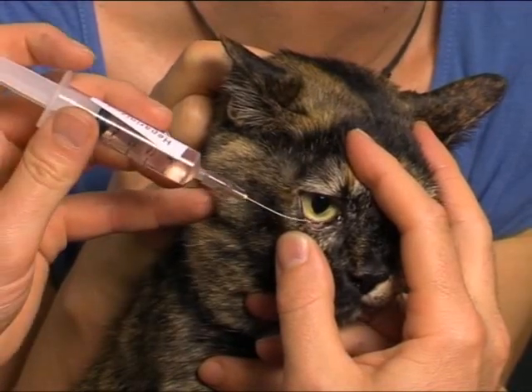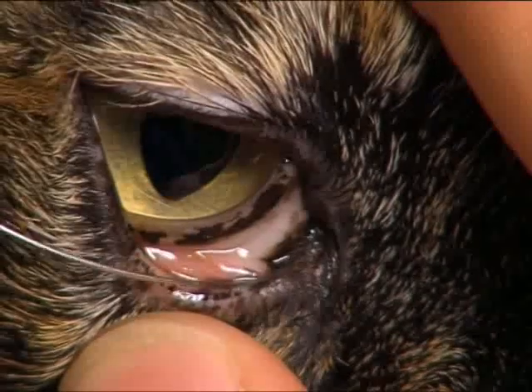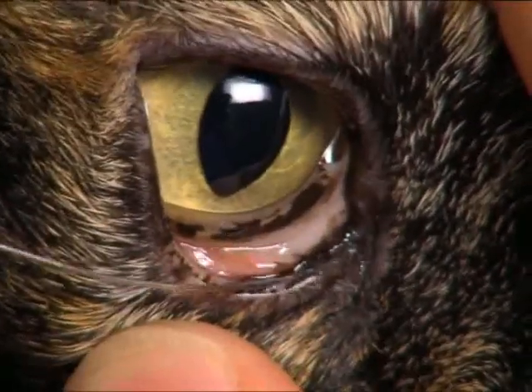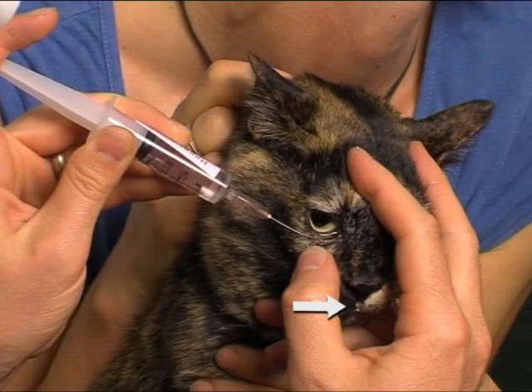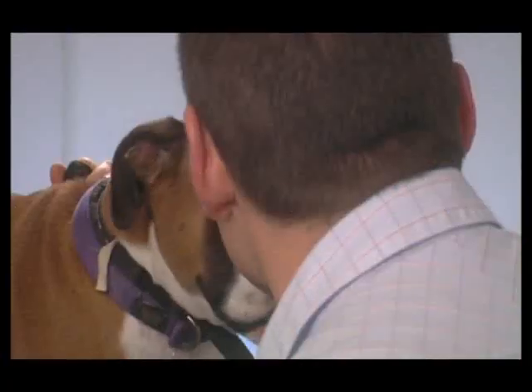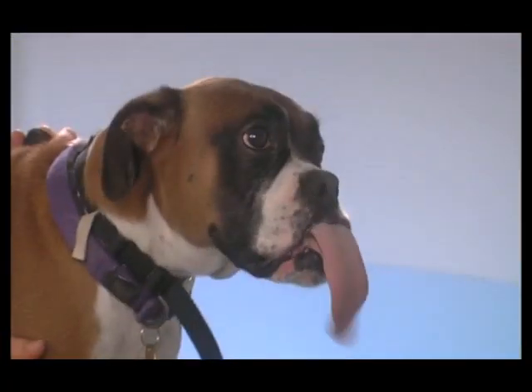Both lacrimal puncta should be cannulated in turn, using gentle probing if necessary to locate the opening of the punctum. Saline is then introduced with gentle sustained pressure. In this case, saline emerges from the nostril. If the duct drains into the mouth, the animal typically reacts by licking or swallowing when the saline reaches the tongue.